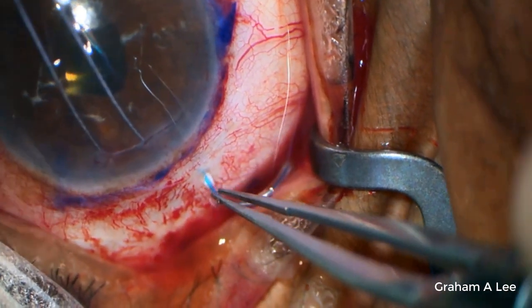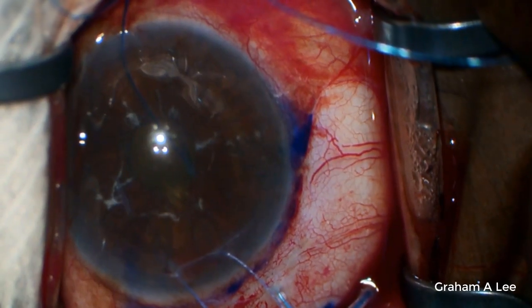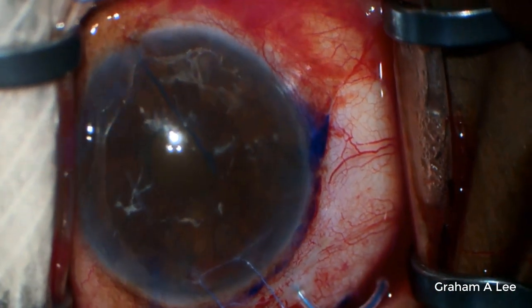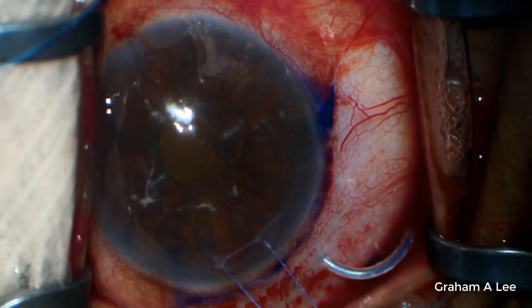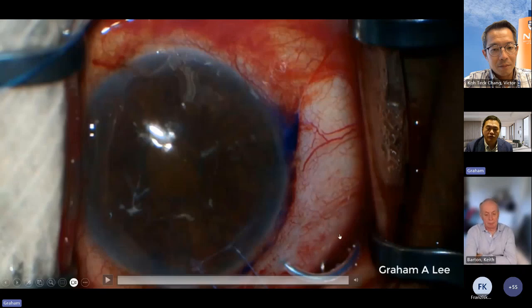So you've got that proline hanging out there, so you cut it short. And as I said before, I have the proline on a needle in the inferior fornix, so I can just pull it back just to the end of the tube, and that gives you a tube in the sulcus. And the other cool thing is you can adjust the length of this tube in the eye by doing a curve type entry, and that's something that Mitch Lawler in Sydney presented on a few years ago, and that's a nice technique to be able to adjust the amount of tube in the eye itself.